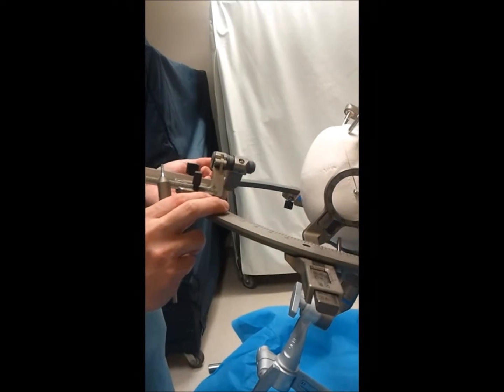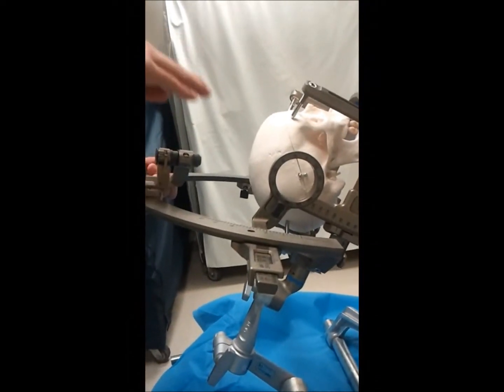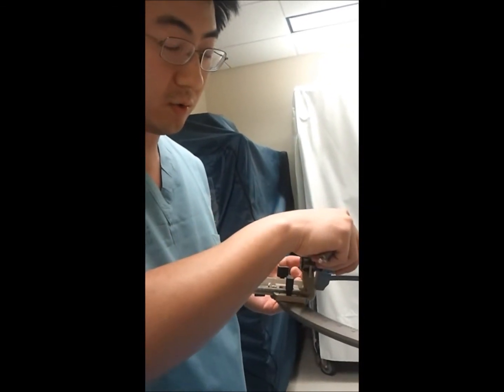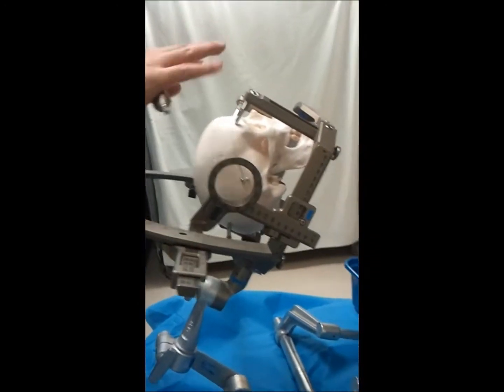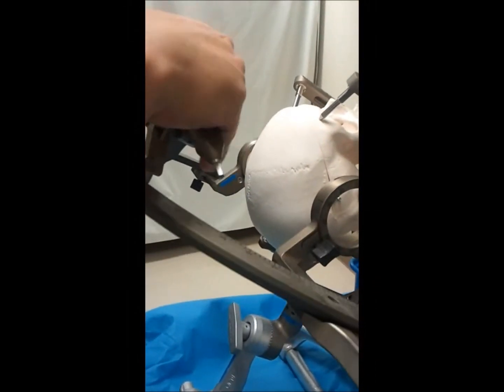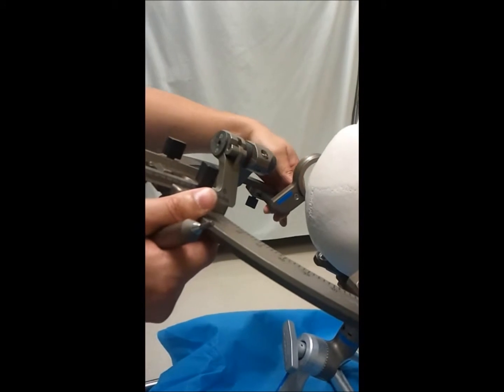The next portion of our procedure is going to be, besides lining up the numbers, getting ready to drill our hole with whether it's a burr hole craniotomy or using the reduction tubes to do a twist drill component. So the patient is all draped, everything's sterile. We have a portion of the skull that we're going to go through, and that area is ideally prepped and clear. And so what we can do are the following.